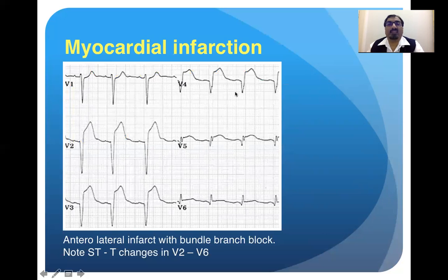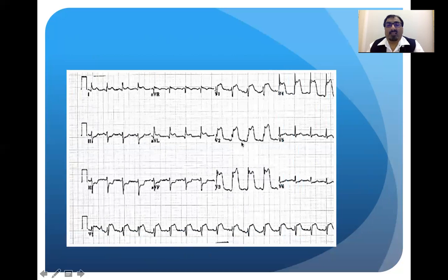Accordingly, you have to deal with these complications. Again, in this particular ECG, you find that there is ST elevation in V2, V3, V4, which is suggestive of an anteroseptal infarction of some duration, and there are reciprocal changes in II, III area. All the reciprocal changes are showing us that the prognosis is bad as compared to the ST-T changes in which the reciprocal changes do not occur. And this is again an acute MI.